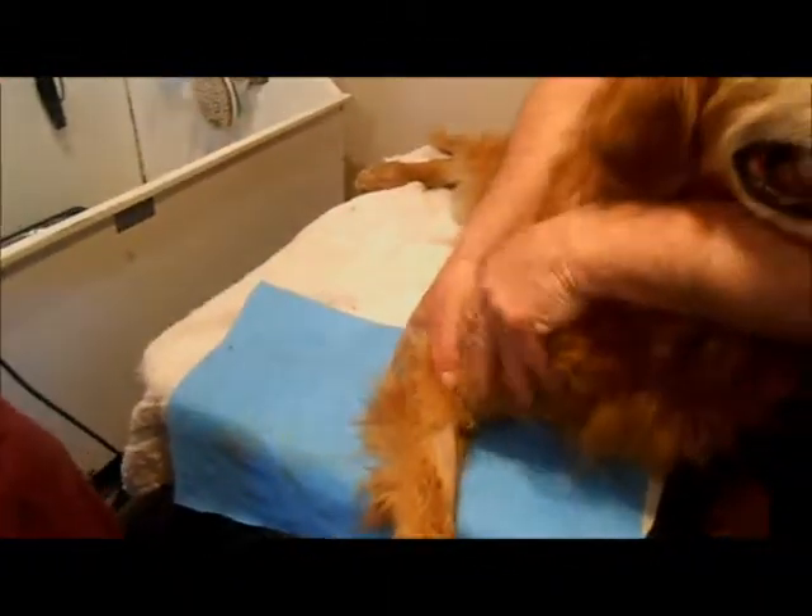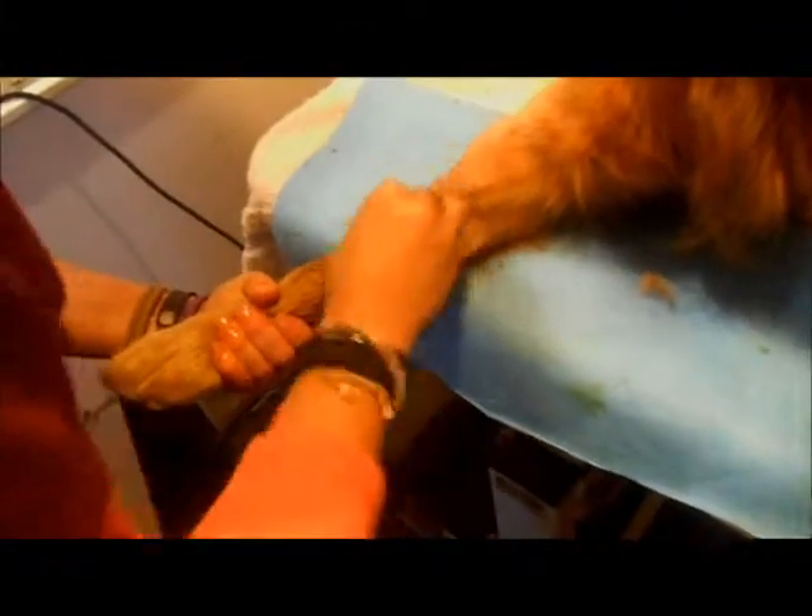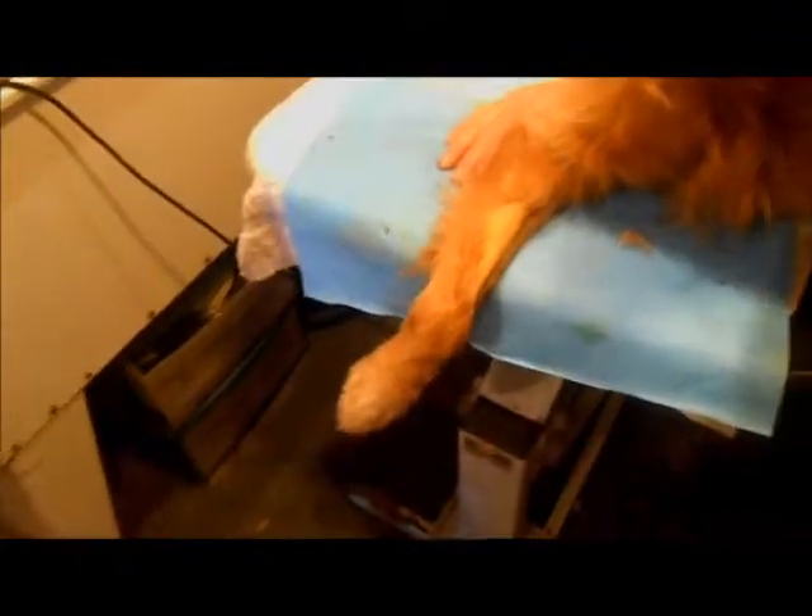Get back up a little bit. Povidine scrub first, alternating with alcohol.